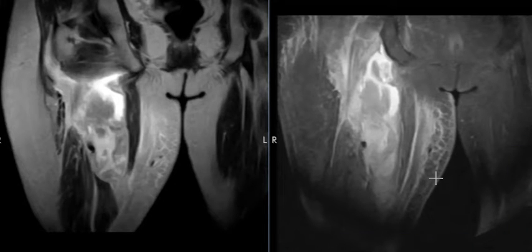Hello, this is Dr. Gay from First Lake MRI, and this is a 58-year-old female who stretched her leg doing the splits accidentally out on a boat and felt pain in the back of her buttock area and her proximal thigh. She had hemorrhage back there, classic signs for a tear of the hamstring tendon.